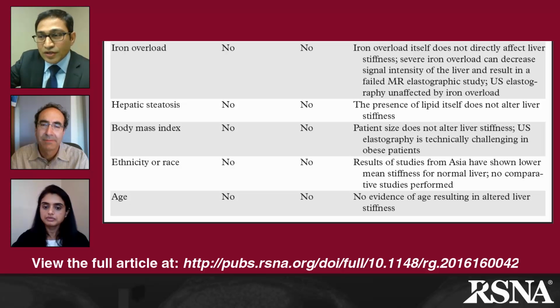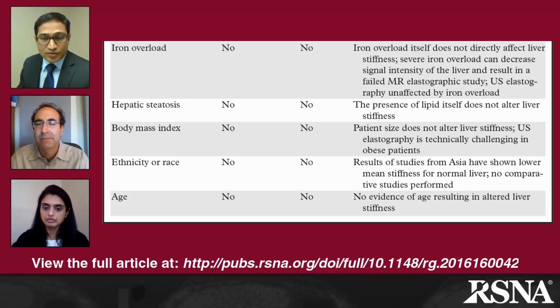And lastly, going to the lower part, as I already mentioned, hepatic steatosis or fatty change per se does not affect the stiffness evaluated by MR elastography. There have been a lot of studies that have proven that. But there are some studies which have shown that ultrasound elastography may show an increased stiffness in these cases. So you have to be careful in those patients who have high BMI, a lot of fat, and you're suspecting that they may have a bit of steatohepatitis, they may have a higher increased stiffness.